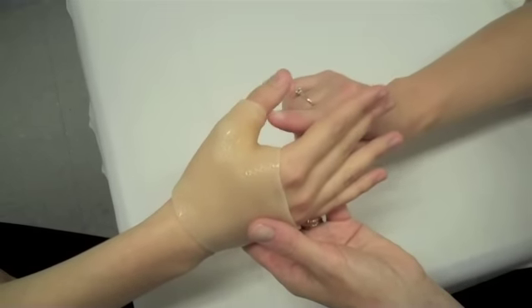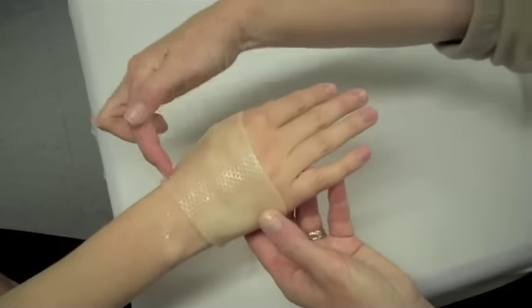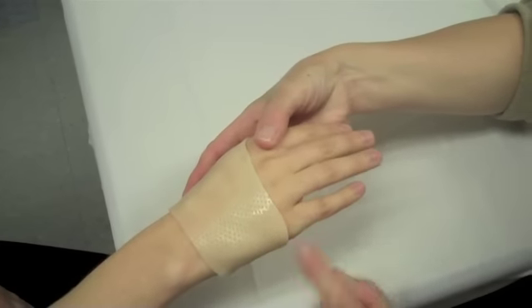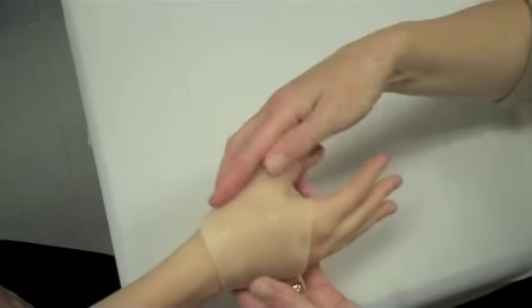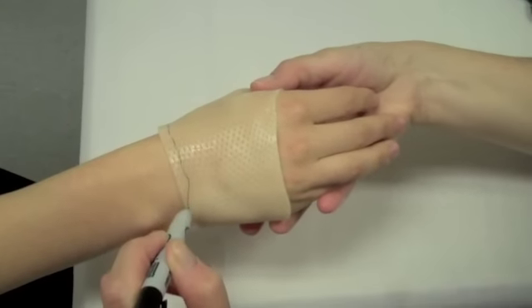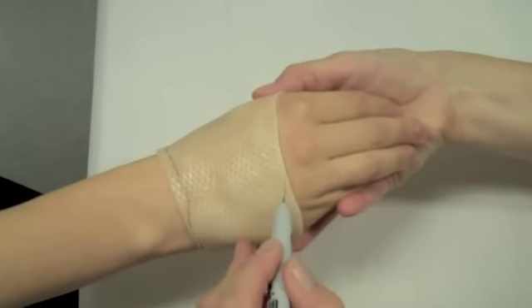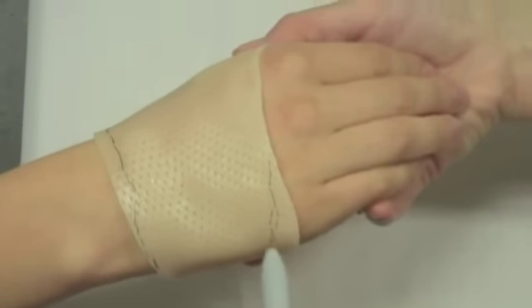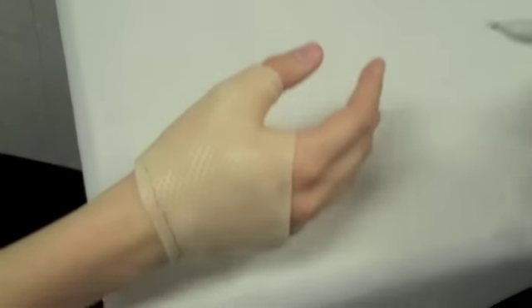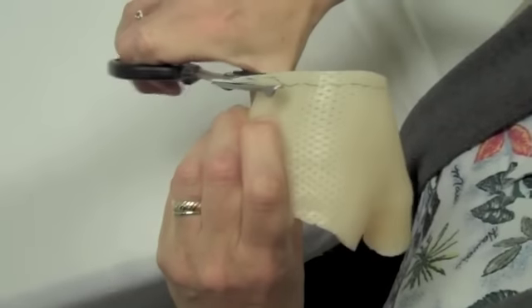Note how the splint is blocking IP flexion as well as wrist extension. It is also too high by the 4th and 5th MCP joints. Mark the excess areas so that you can make the necessary adjustments. Remove the splint from the patient's hand. Cut off the extra material including the ink.